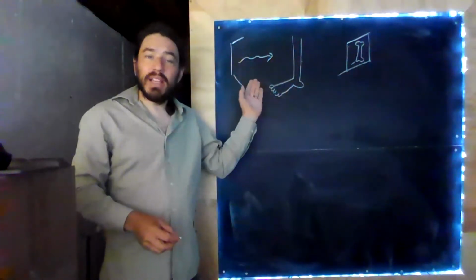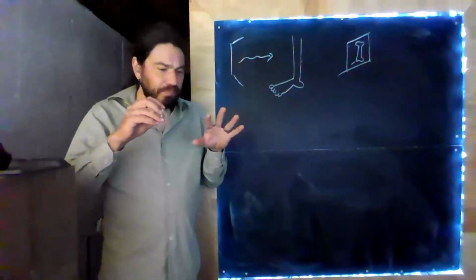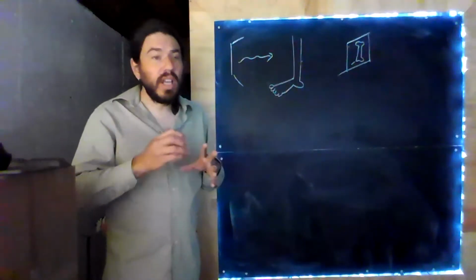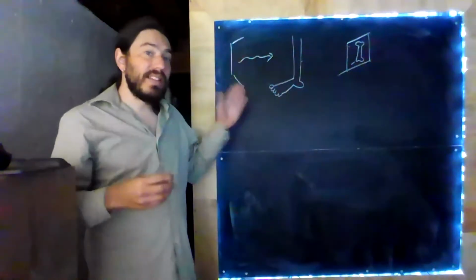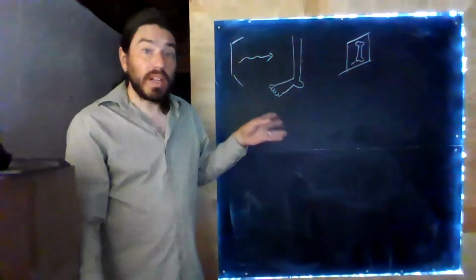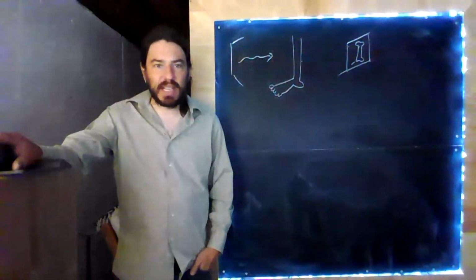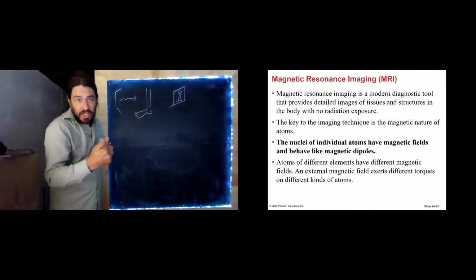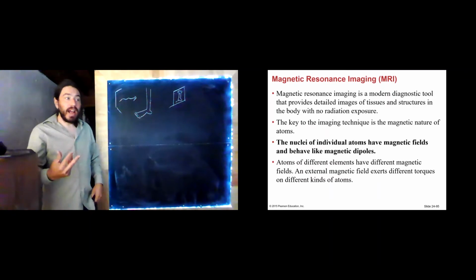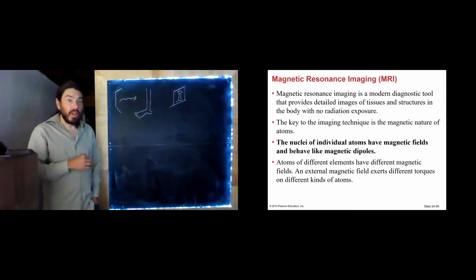It turns out an MRI is much like this. In this case, we're getting an image of where the X-rays were absorbed, right? So we're able to get an image of the inside of the body by seeing where these X-rays got absorbed. Now, MRI works in a similar way to this, but it's a little bit more sophisticated, and an MRI can give you some spatial information that an X-ray can't. An MRI, however, uses magnetic resonance imaging to create a three-dimensional image of the body.